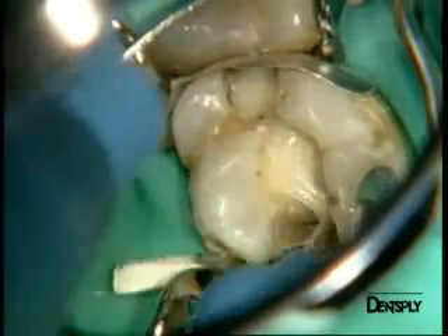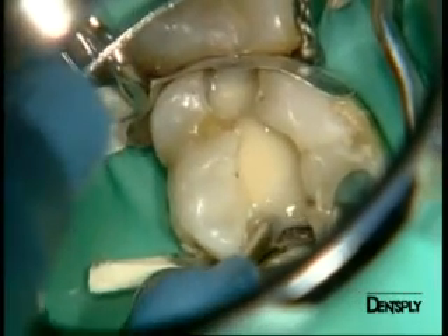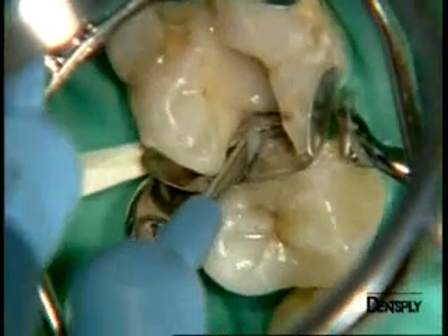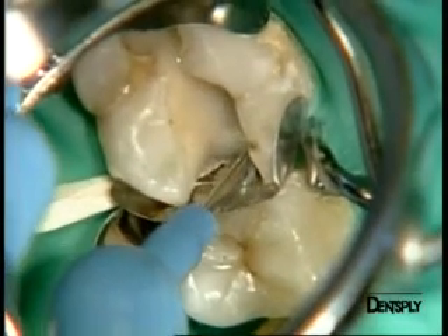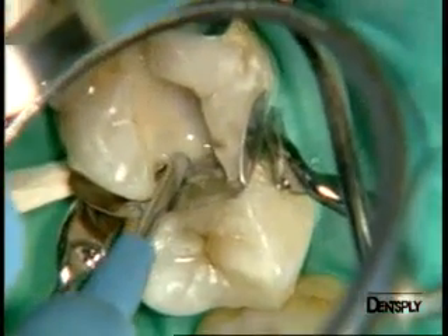We use the opaque shade OA3 to mask the dentine that has a grey discoloration caused by corrosion of the amalgam. We apply a second layer of X-Flow OA3 into the mesial section. This shade will be polymerized for 40 seconds.